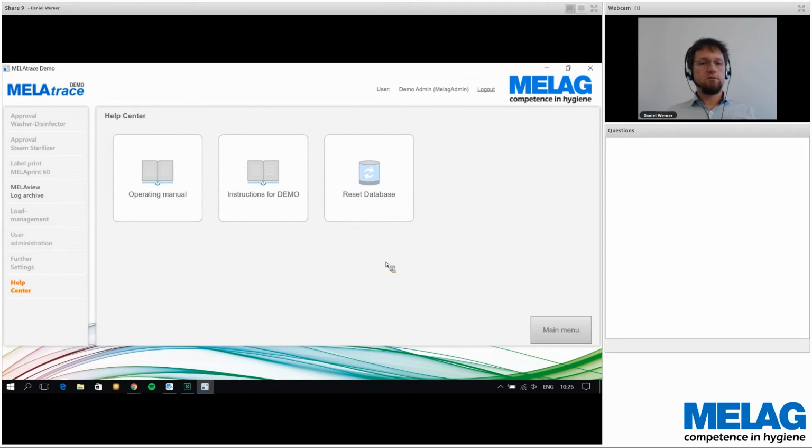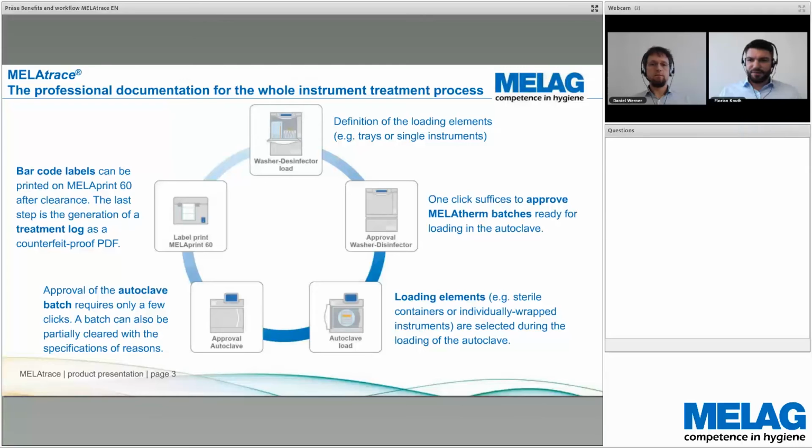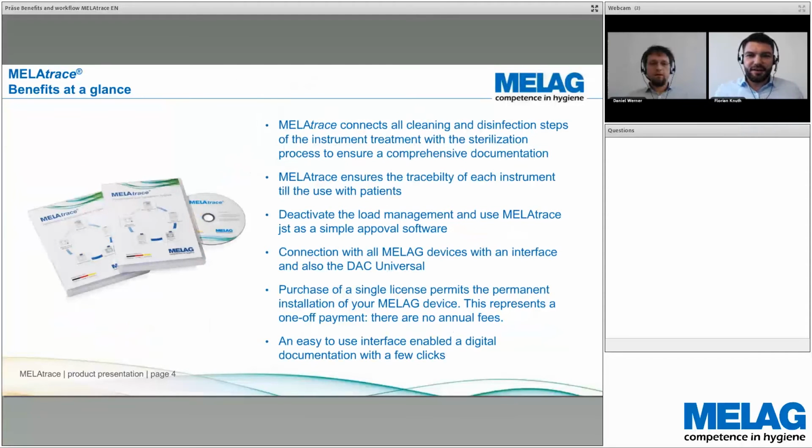Okay, thank you, Daniel, for that nice presentation of MELAtrace. The demonstration version you have now seen presented by Daniel, we can provide you after the webinar with a link. You can download it, and then, independently of connection of devices, you can use the MELAtrace demo version. I think it would be a good help for you to learn more about the software and all features and functions.